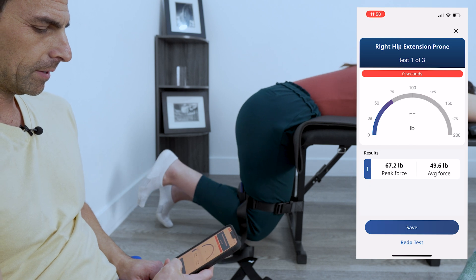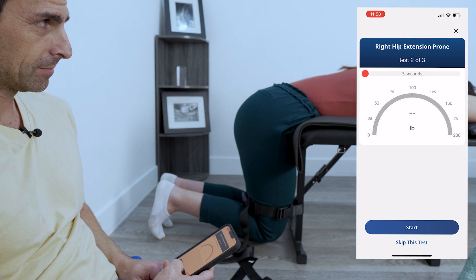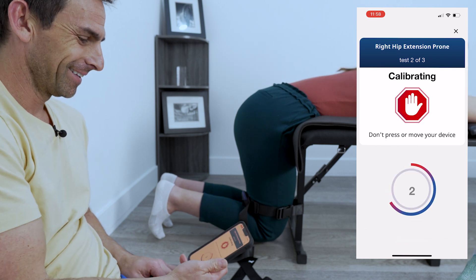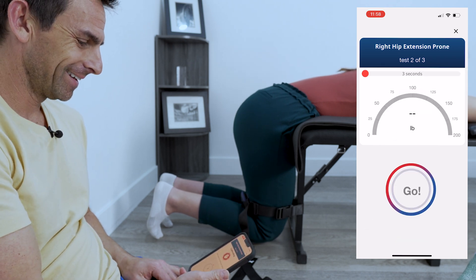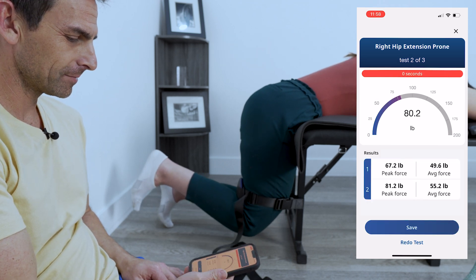All right, go and take a break. All right, ready again? Is it hard? Nope. I might have just shouted into the microphone, sorry. And go, go, go, go — come on, come on, come on. Good job.